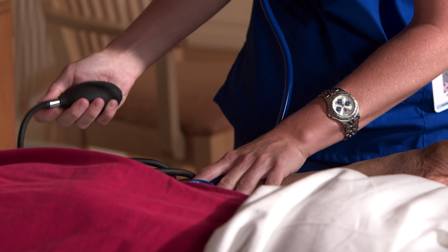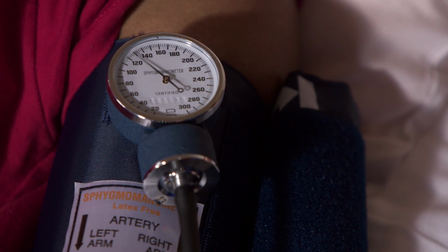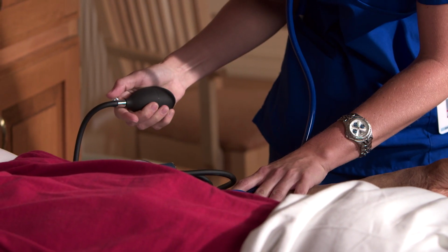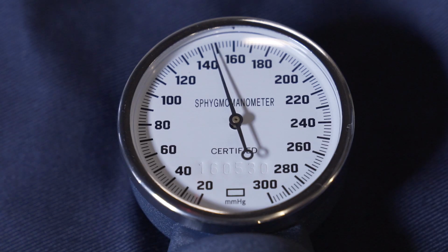Turn the screw to the right or up and pump the bulb to inflate the cuff to 30 millimeters of mercury above the estimated systolic blood pressure. You should no longer be able to hear the pulse. Turn the screw to the left or down and let the air out of the cuff slowly, at about 2 to 4 millimeters of mercury per second.